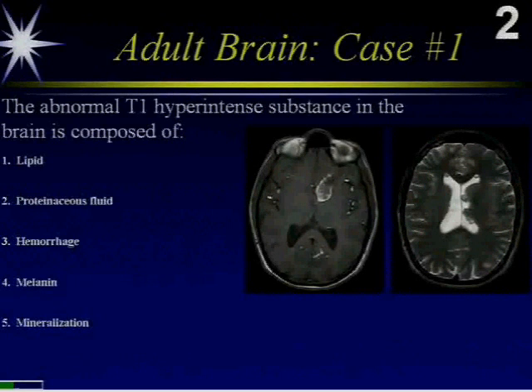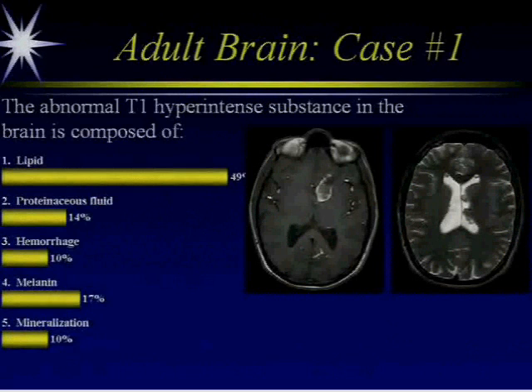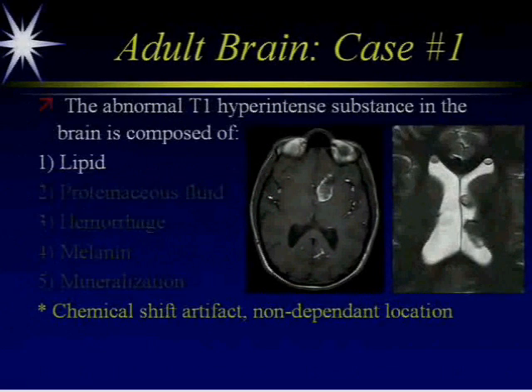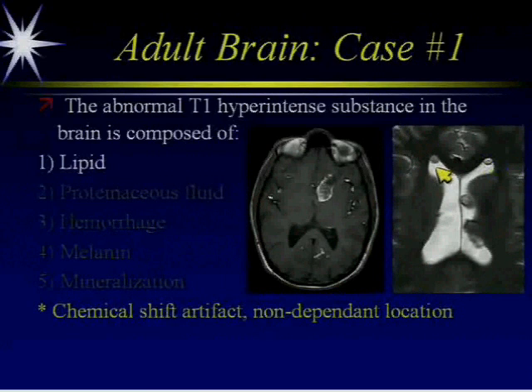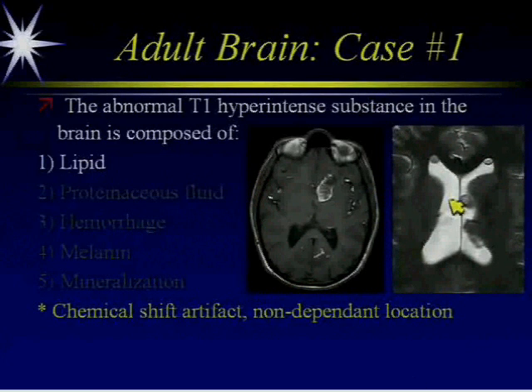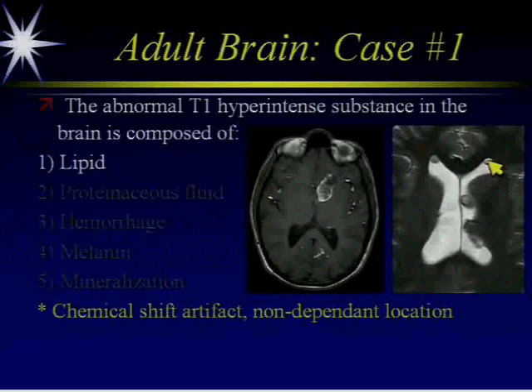The correct answer is lipid. The reason we know this is lipid is these drops that are floating ventrally in the CSF. In addition, we can see the chemical shift artifact at the boundary of lipid and water interface — there's a dark line inferiorly and a bright line superiorly. You get that at interfaces of water and lipid; that's known as chemical shift artifact.